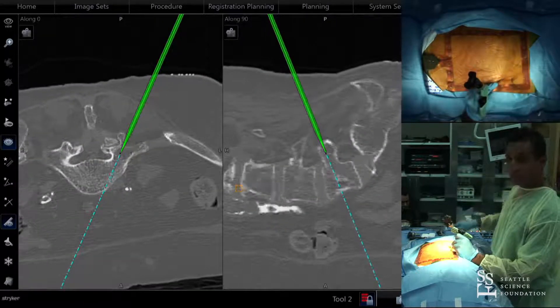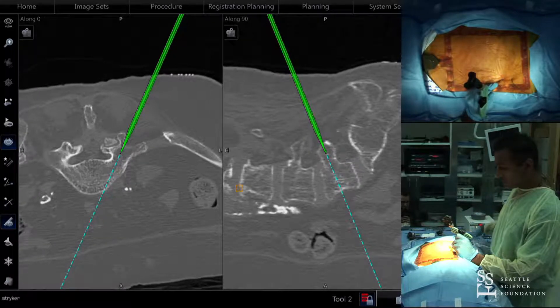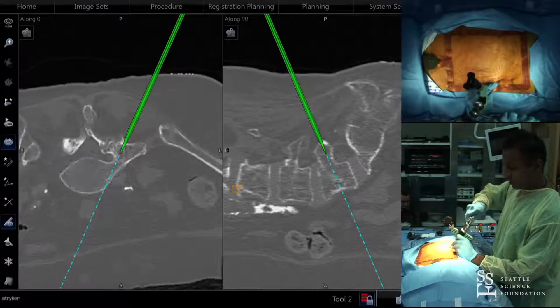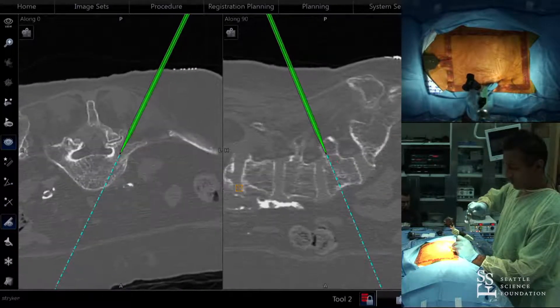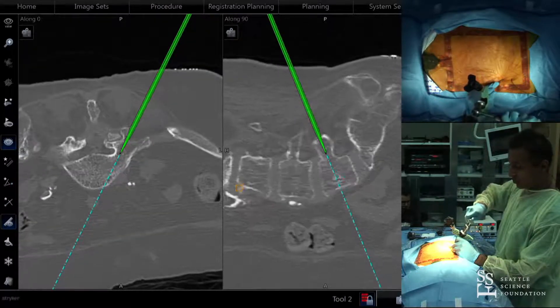Sometimes incisions for L5 and S1 are spread apart, and sometimes they're really close. If the Jamshidi best fits through the same incision, I'll do that and just make the incision a little bigger. The incisions for Jamshidis and guide wires don't matter as much — it matters more when putting screws in with extended tabs.